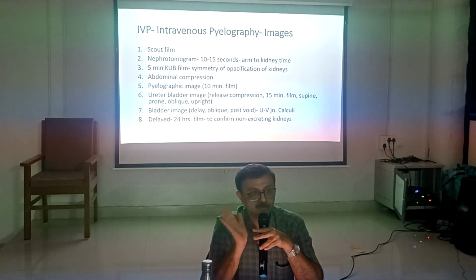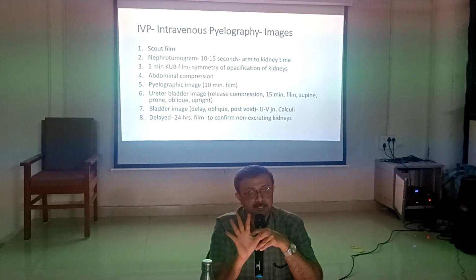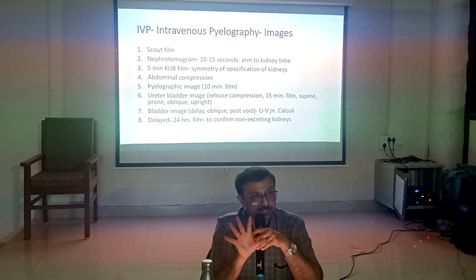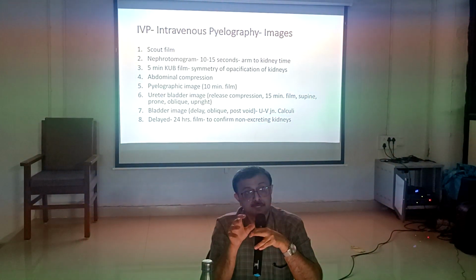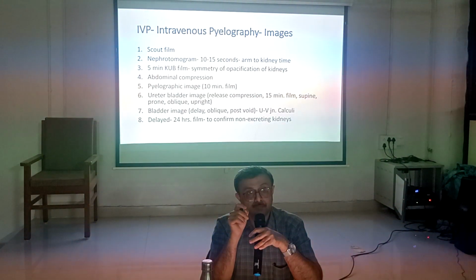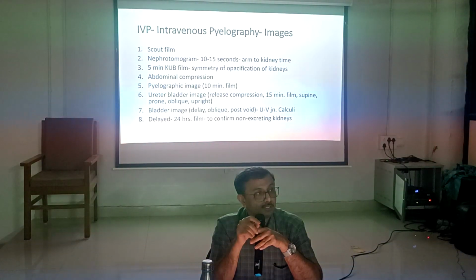The IVP study is not to diagnose stone. The IVP is not for proving that the stone is there. The stone is already there. IVP is for anomalies of the urinary tract. So whenever we intend to do any procedure in the urinary tract, it is always preceded by urography.